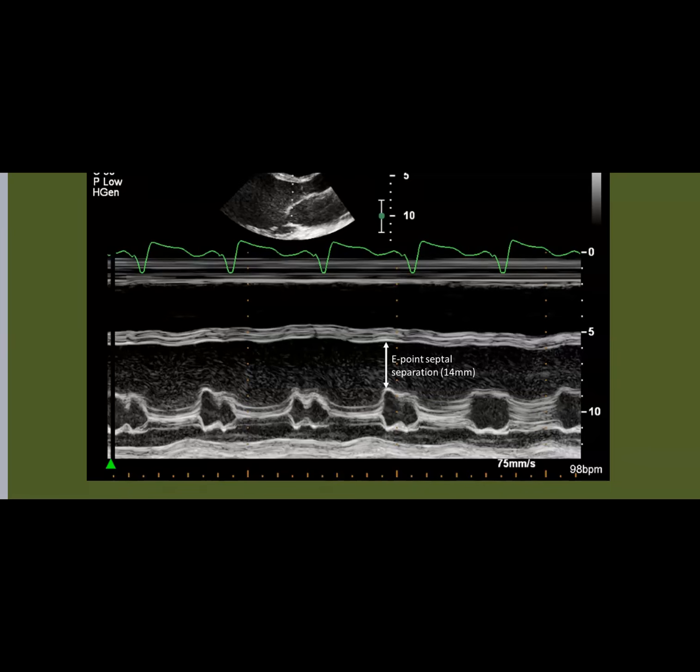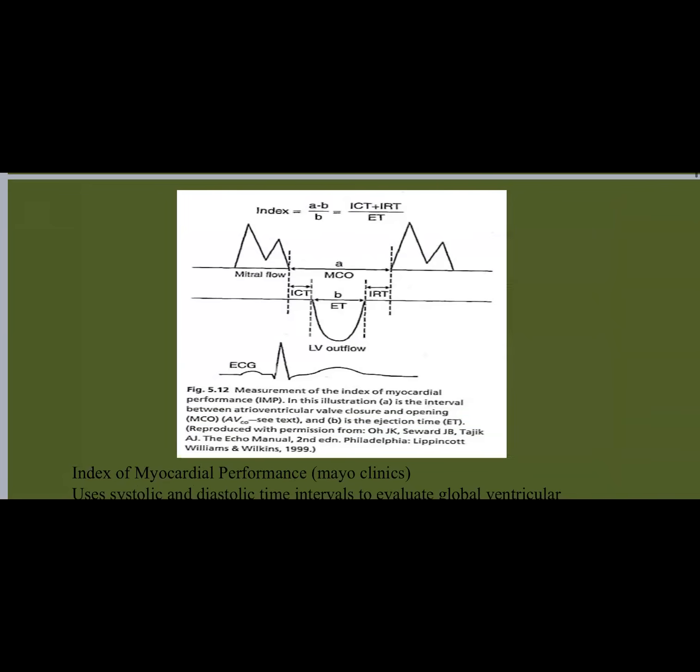Now you probably heard about the TEI index, and the other name is the index of myocardial performance. The TEI index is so far used just for research purposes and academia. We don't use it practically a lot, but it's still a source of questions in exams and interviews, especially if you go for echo boards, you may see it. But usually it's not really practical in reality. But it's good to know about it.